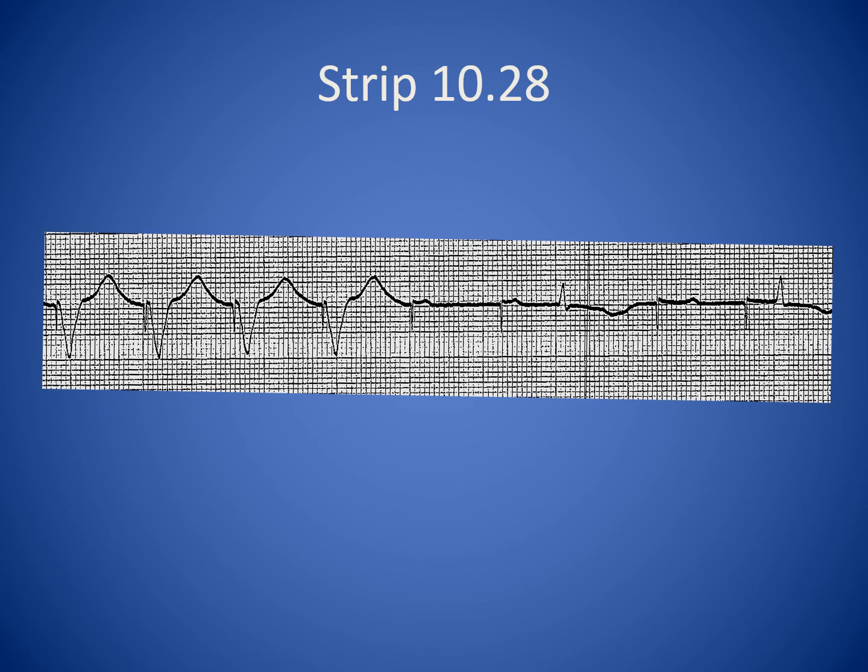And the book does not address the bumps following the spike, not followed by the QRS, but looking down at the strip, the thing between the spikes looks like a P wave. And we're wondering if they are the patient's own P waves that coincidentally came after the spike. Again, if you measure out the P to P, it's probably like a complete heart block or something.